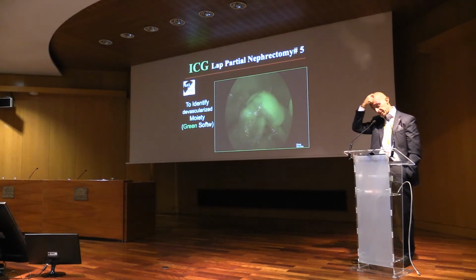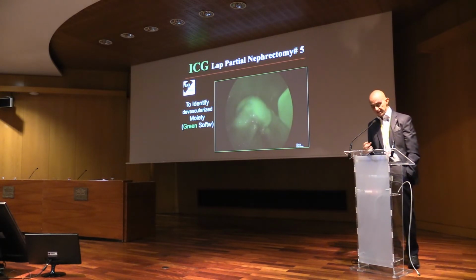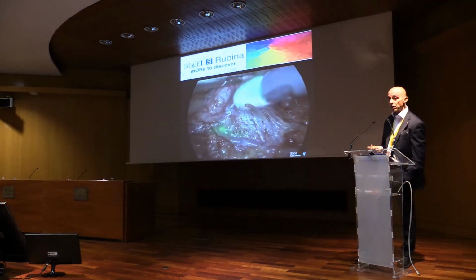Next. And then this is the same thing on the other side. Using green software, you can see the lower pole devascularized. For this reason, you can use this technology for several steps of the technique. Next. And for sure, in color is better.